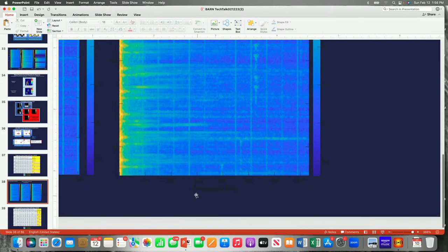And here's stuff that's really a giveaway. See this? Lub, lub, dub, shh. Now that turns out to be a valve.